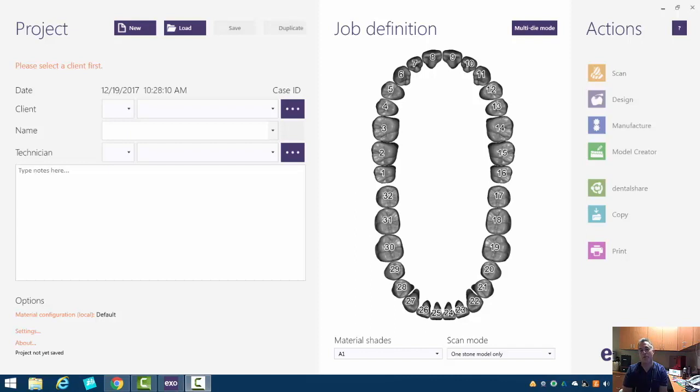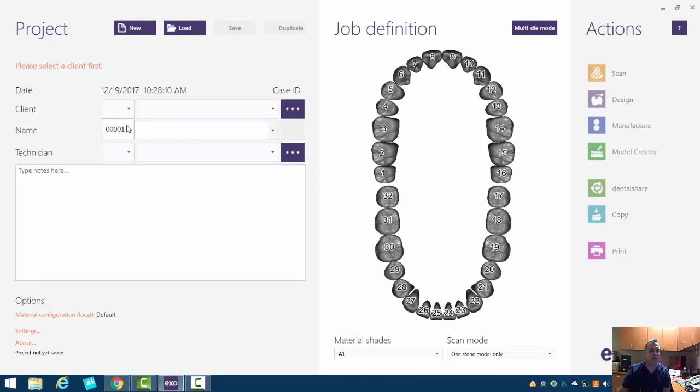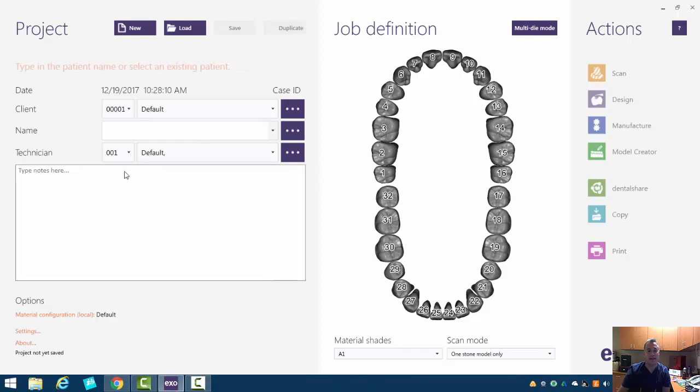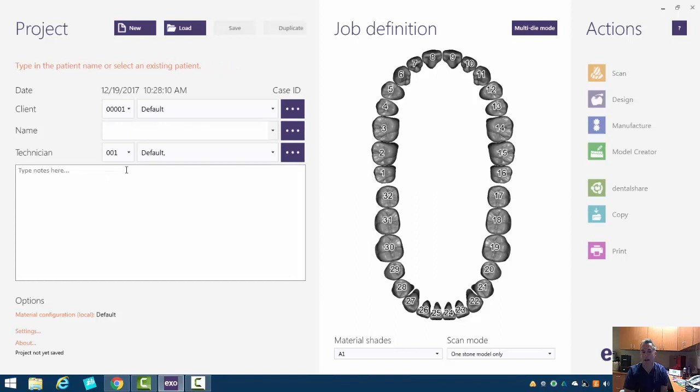So tooth number three is a tooth that we're working on. Before we do any of that, we need to enter in some data. ExoCAD currently, this build is for dental labs, so it asks you for a lot more information than you probably need.